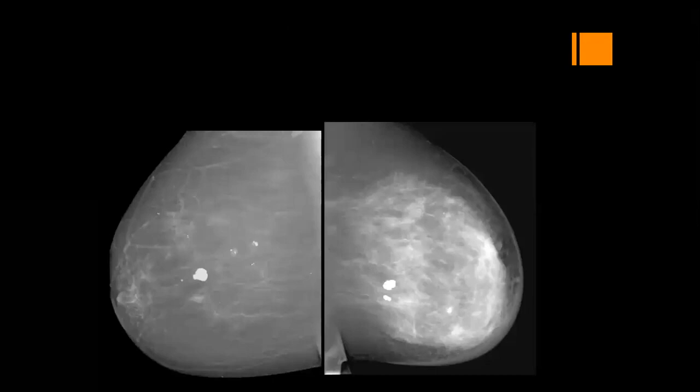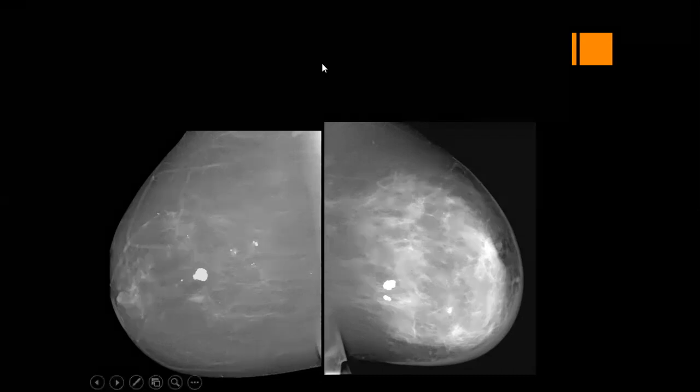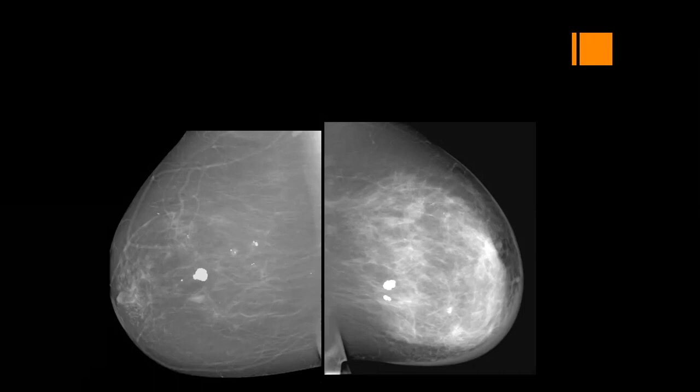What about this mammogram? Can you see the abnormality here? In the left breast, there is diffuse skin thickening associated with global asymmetry and thickening of trabeculae. This large macrocalcification is a benign calcification, most likely representing involuted fibroadenoma, which is bilateral.